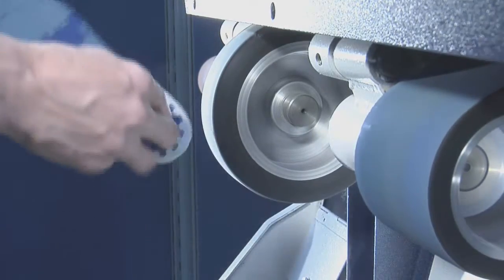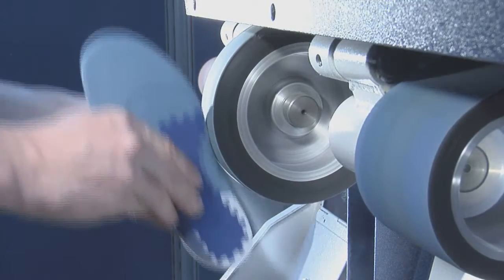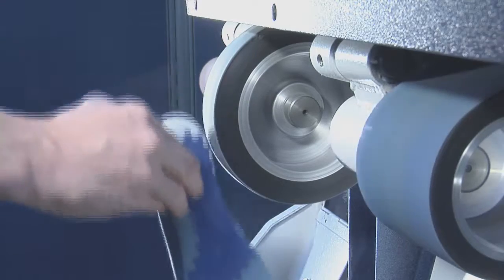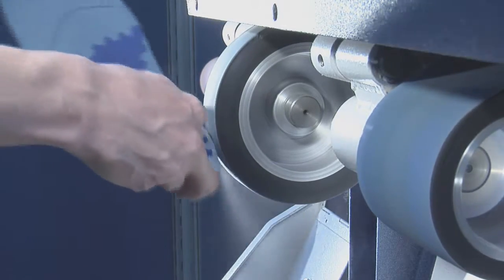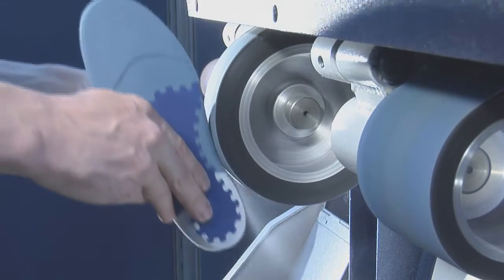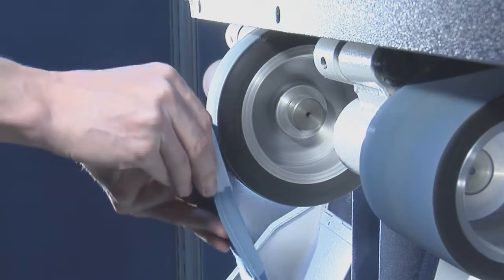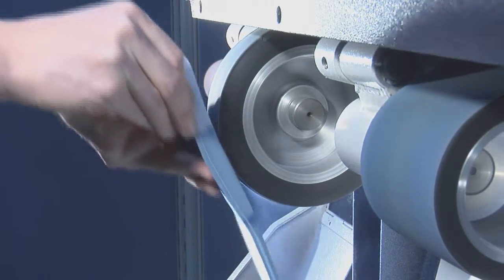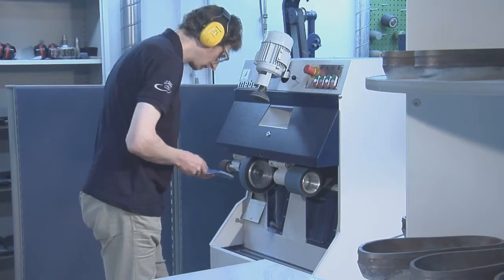The orthotic shape must be compatible with the inner shoe shape. For best fitting results, grind a tapered shape similar to the inner shoe shape. Depending on the ankle height and cushion demands of your customer, the bottom side material is usually ground thinner up to the stabilizing fiber layer. After reducing the material, the orthotic side shape needs to get ground to meet the inner shoe shape.